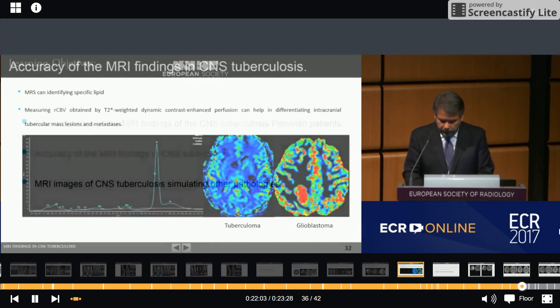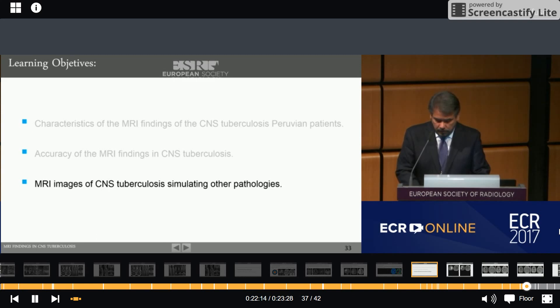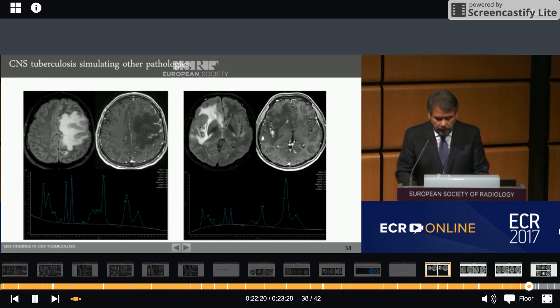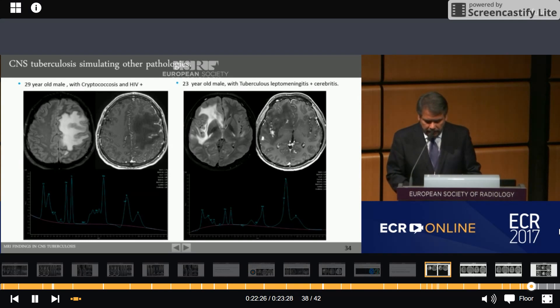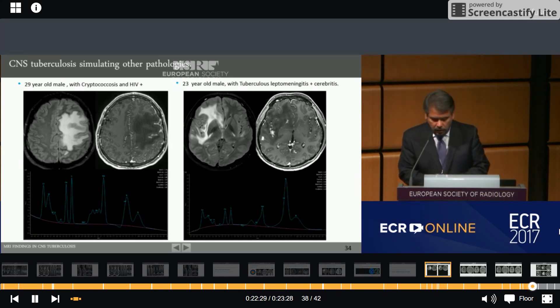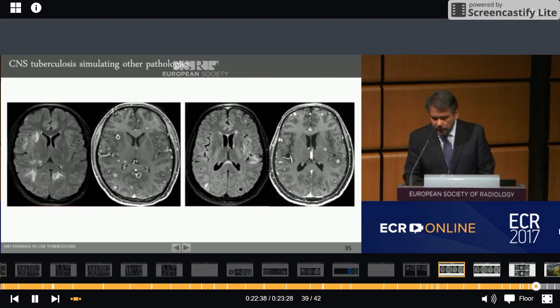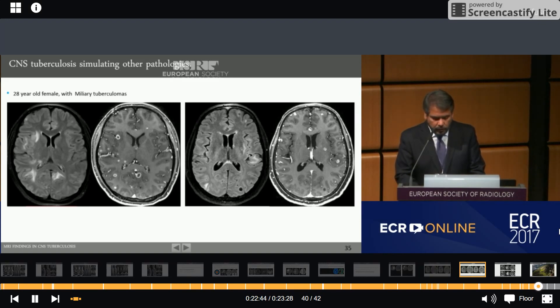MRI images of CNS tuberculosis can simulate other pathologies, making these cases very similar and difficult to differentiate. A 29-year-old male with cryptococcus and HIV is compared to a 23-year-old male with tuberculous leptomeningitis and cerebritis. A 28-year-old male with tuberculoma is compared to a 54-year-old male with neurocysticercosis.